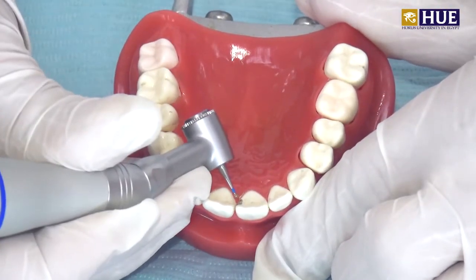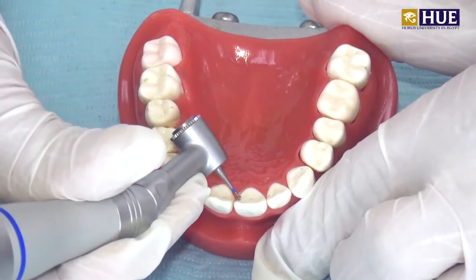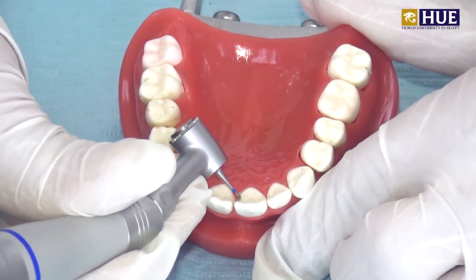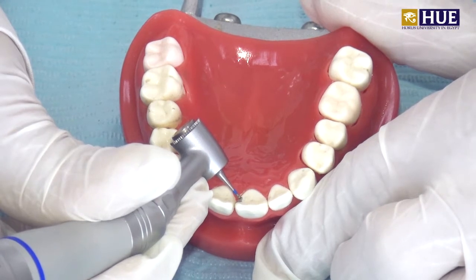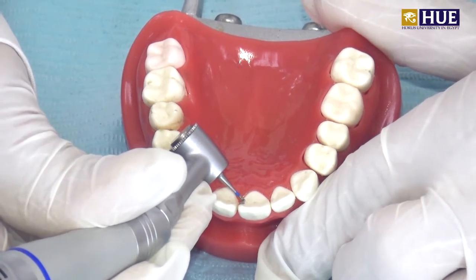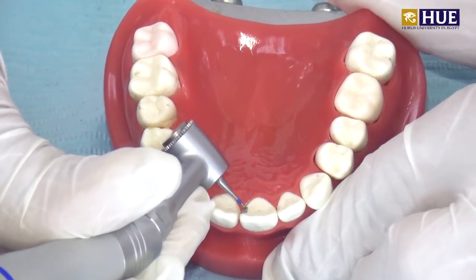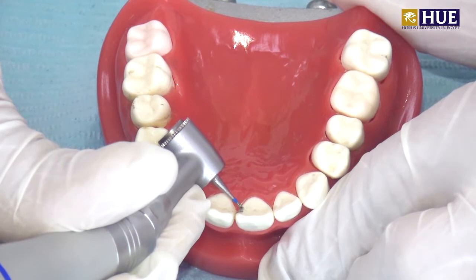Then the starting point or entry should be from the distal or mesiolingual direction like this, with the neck of the round bur toward the gingival embrasure. This direction keeps you parallel to the enamel rods in this area.